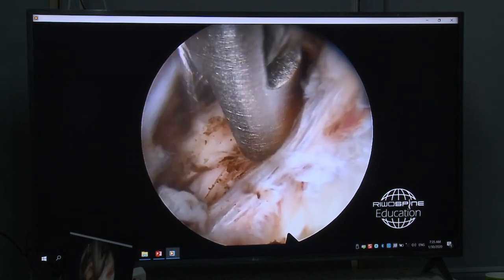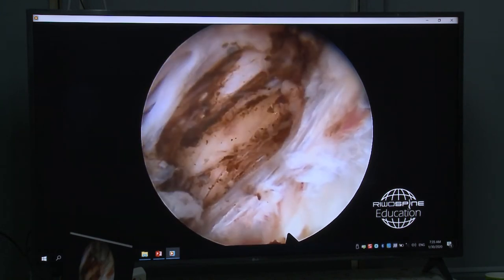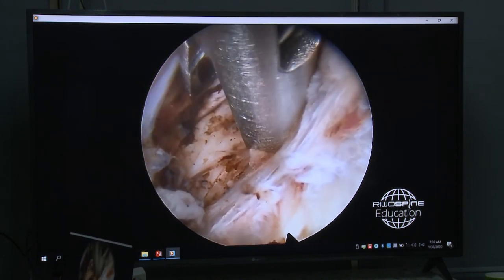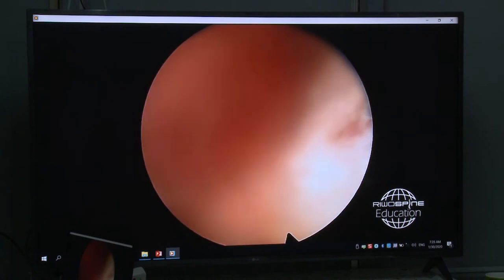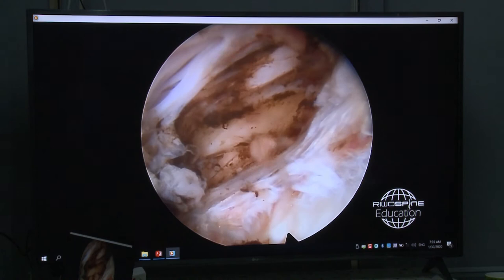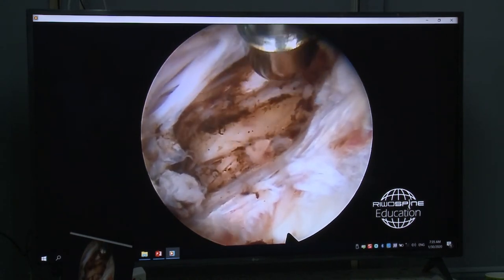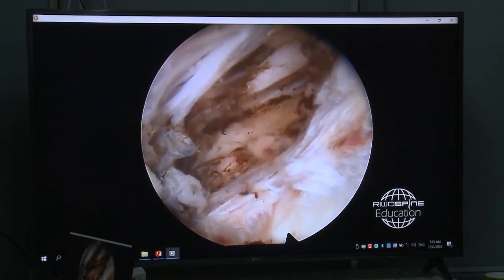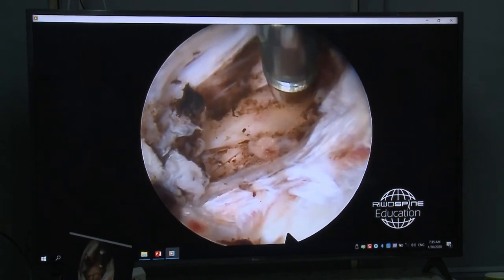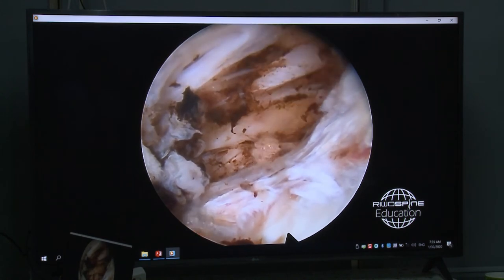Then you see already a neurostructure. Some vessels here, so I hope it will not start to bleed much. These are the vessels that you normally know from the lateral recess, and in the interlaminar approach it's also useful. You see now clearly the neural structure here, the L5 nerve.